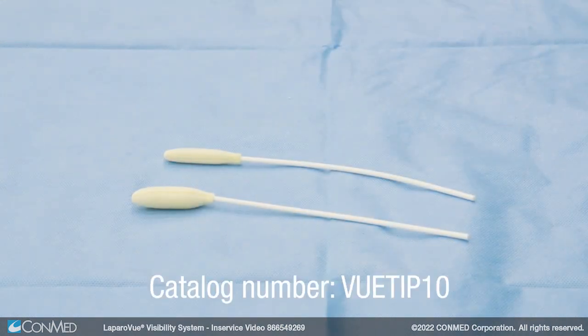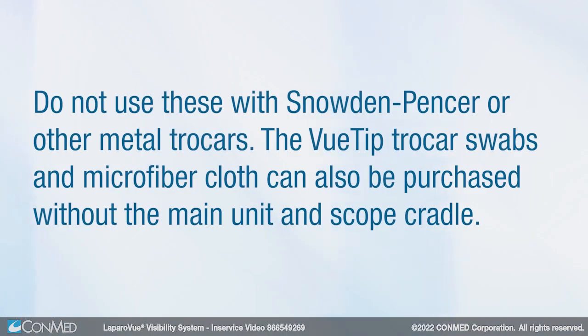The view-tip trocar swabs are provided to clean the inside of trocars. The small trocar swab is for 5 to 8 millimeter trocars and the large is for 8 to 12 millimeter trocars. Do not use these with Snowden-Penser or other metal trocars. The view-tip trocar swabs and microfiber cloth can also be purchased without the main unit and scope cradle.